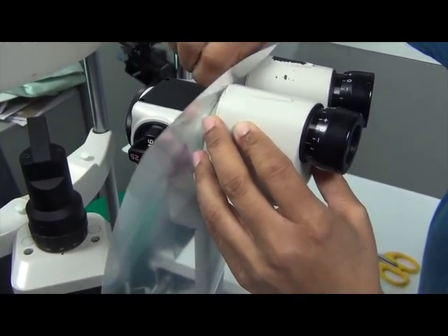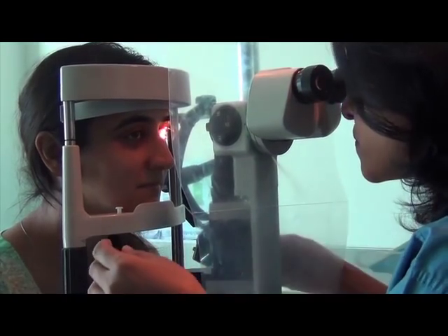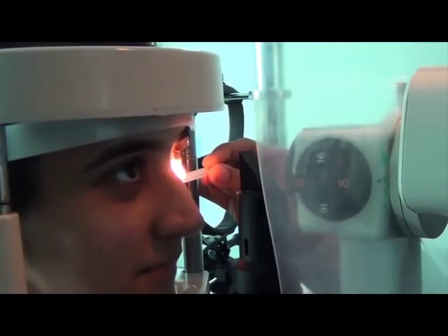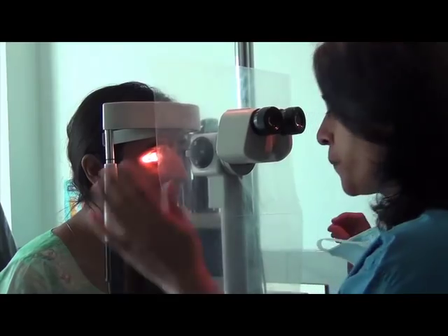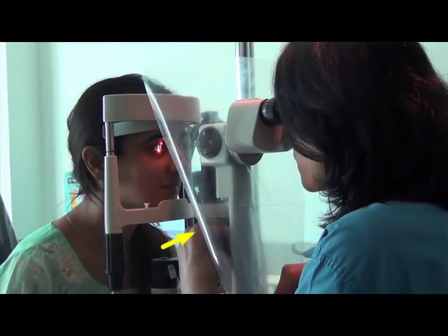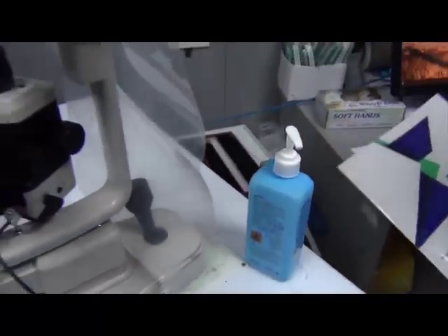This now acts as a very stable breath shield and you can see patients easily. It is important to make sure that as your hands go around the sides of the shield, you flex or fold the shield outwards and not inwards towards you, so that your arm does not touch the patient side of the breath shield. As you can see, most procedures can be done easily with the shield in place since it's flexible material, and it can also be easily cleaned.